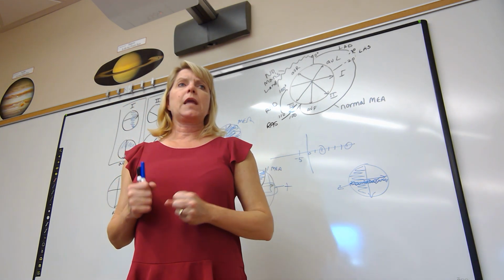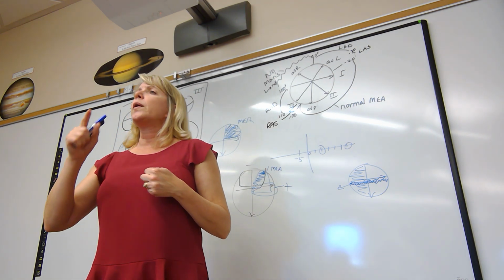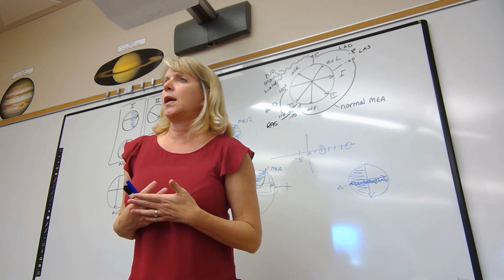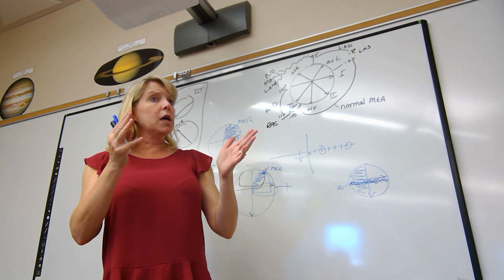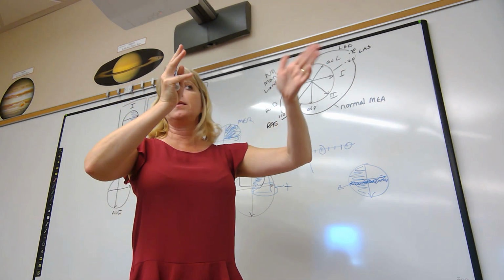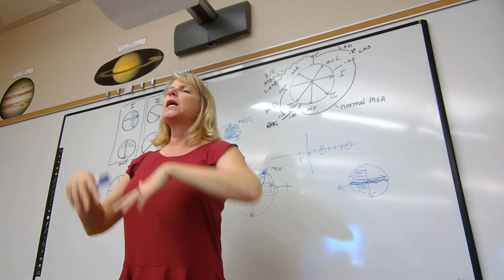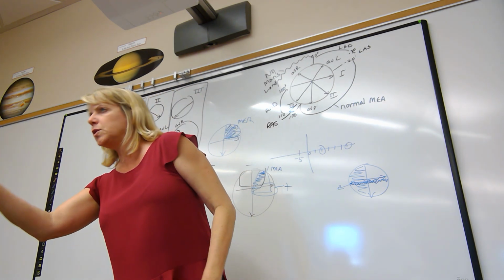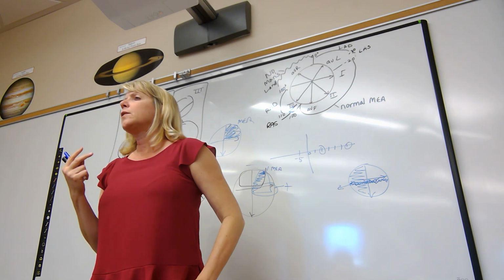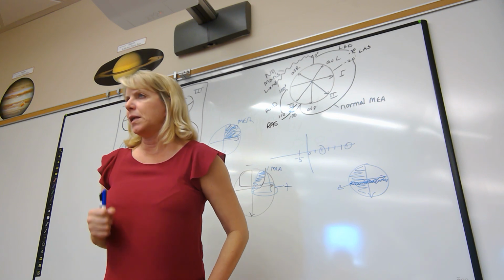Thank you. 2 points for calculating an interval or a segment, which we need to do tonight, and we will. 1.5 points for showing me your work, marking on the lead 2 where you began your measurement and where you ended, and boxing your answer with the correct units. The correct units, Yvonne, for an interval or segment are seconds. So it's the element of time.